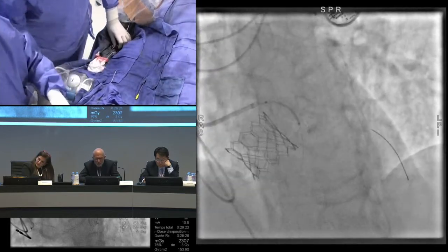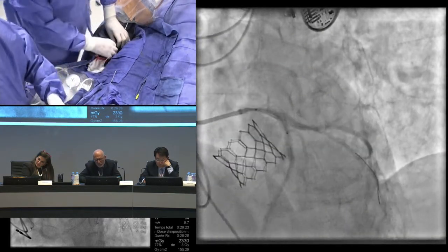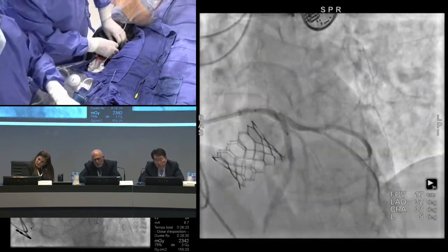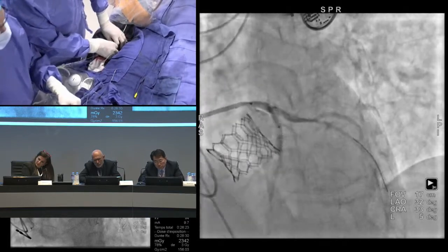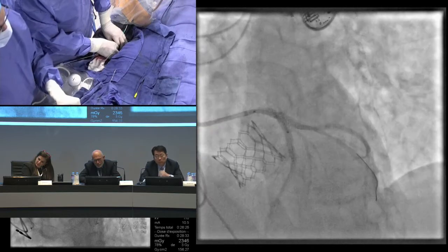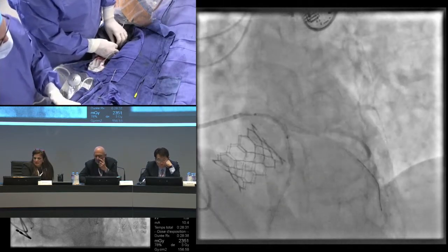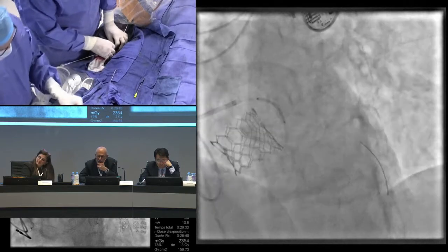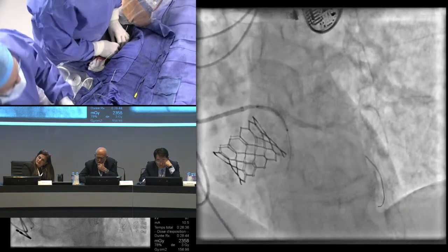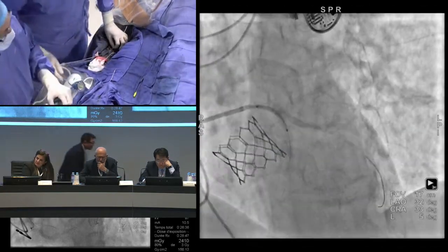Ready? Yeah, picture of that. I think it's not too bad, eh? Look. Maybe you can pull back a millimeter. Yeah, 1 millimeter back. Test. Yeah, I agree. Test. Big shot. I think it's okay here. 1 millimeter back, one more. Big shot. Yeah, I think it's good. Here it's good. Okay.